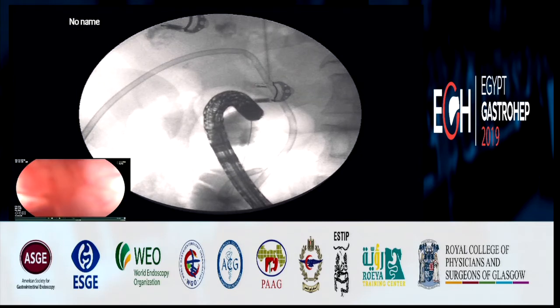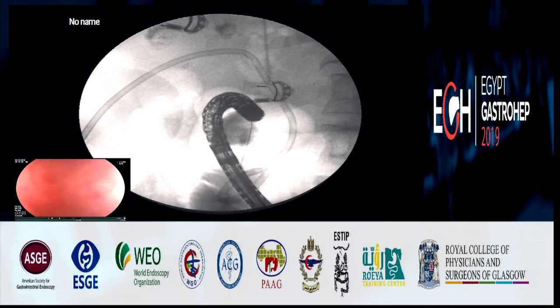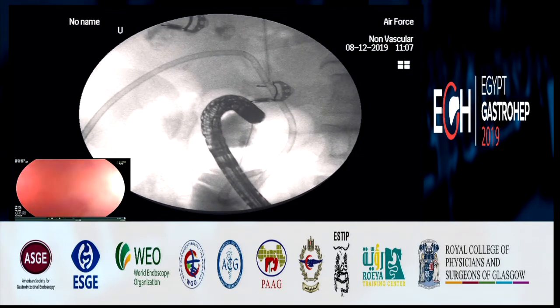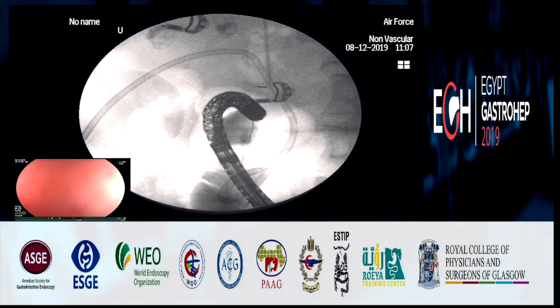You should inject water, not contrast, saline, but no contrast. Yes, to overcome that issue, we will inject saline, and I will try to suck the air, and suck the stomach a little bit. Okay, so yes.